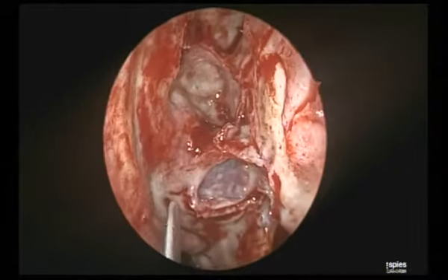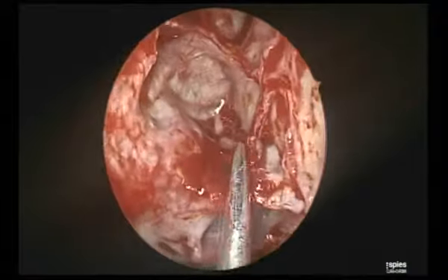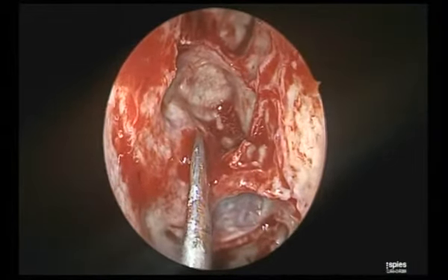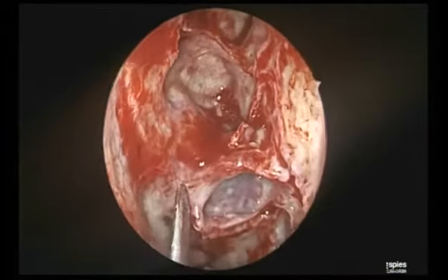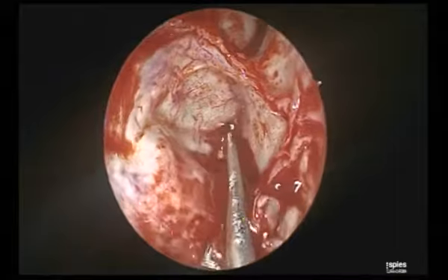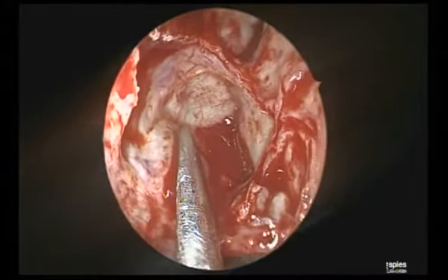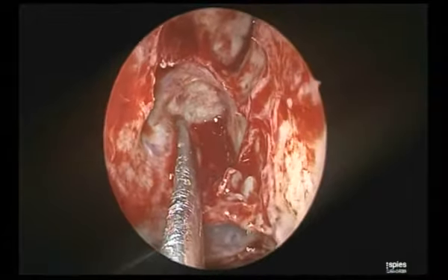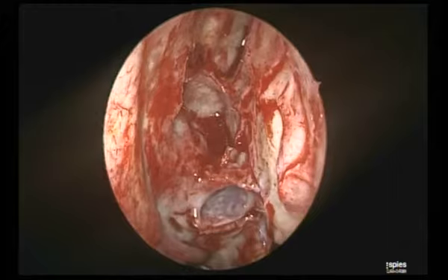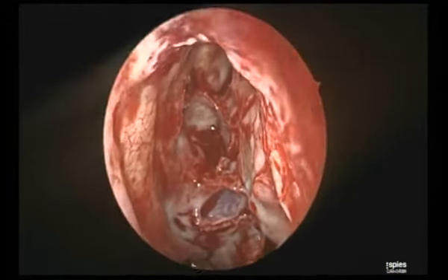See, this is the first part of the turbinate. This is turning, going to the lateral lamina papyracea. This is the second part of the turbinate. Can you see? That is the ground lamella, and this is where the ground lamella is going up to the skull base. Where the ground lamella is attached, if you find it, the anterior ethmoidal artery is a few millimeters anterior to it. This relationship will never change.